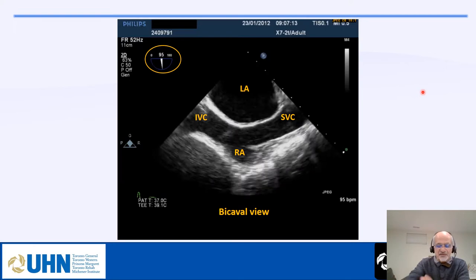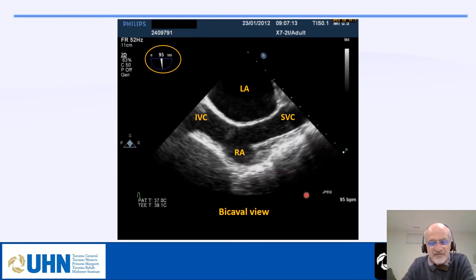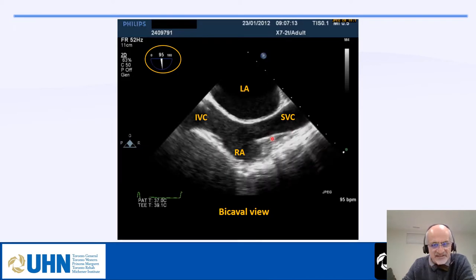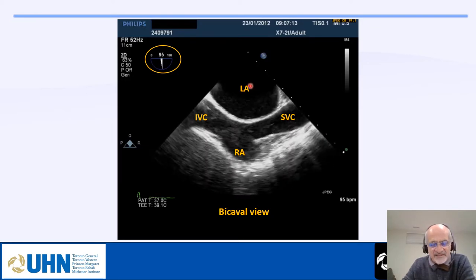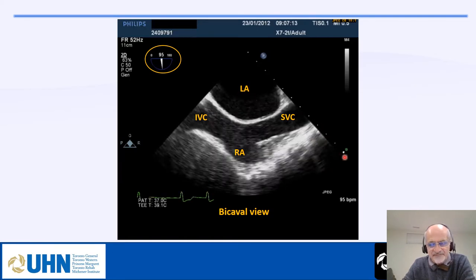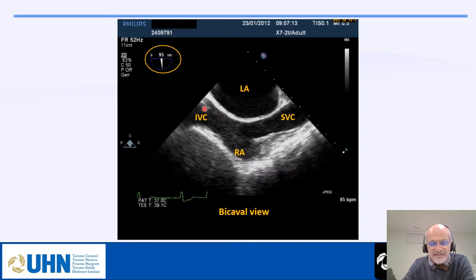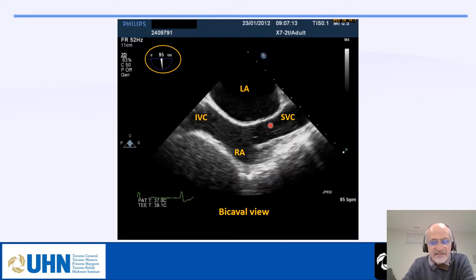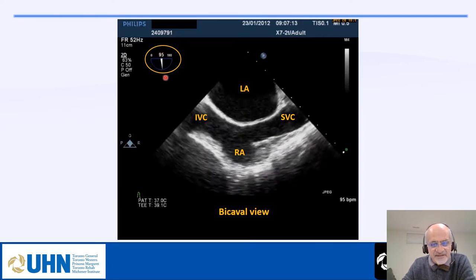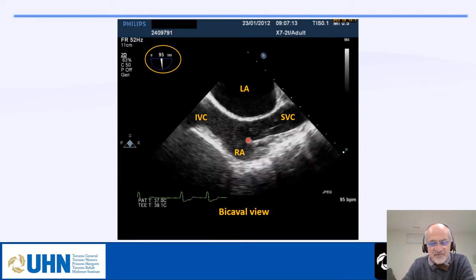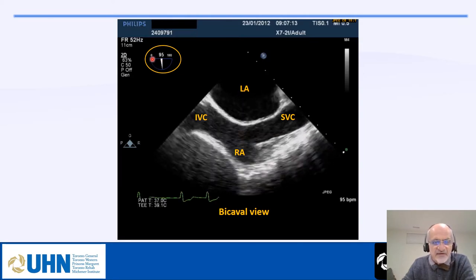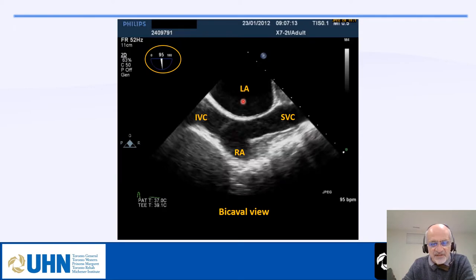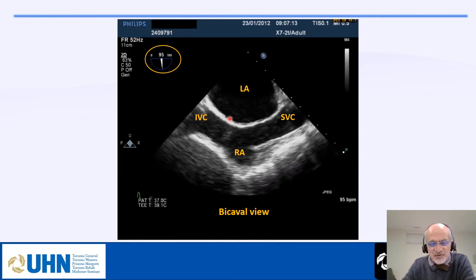For 3D acquisition of the interatrial septum, we first obtain our 2D TEE image in the bicaval view, where SVC is on the right side, IVC on the left side, and the left atrium at the top. Using 3D zoom in this view, we can visualize the septum. We prefer to acquire it at 90 degrees — perpendicular to the interatrial septum — for better spatial resolution, as recommended by the guidelines.